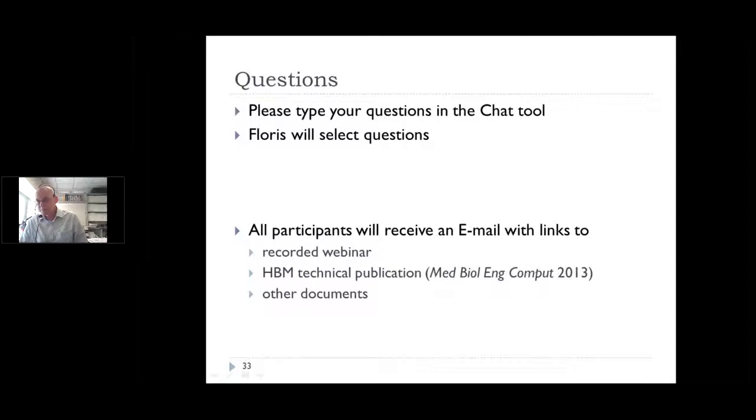Okay, so thank you. We have a question here: HBM reflects an able body. How are you expected to use it in treatment with patients with physical and neurological impairments? If you have impairments, then this whole static optimization may not be applicable anymore, because static optimization assumes that the muscles distribute the load in an optimal way.